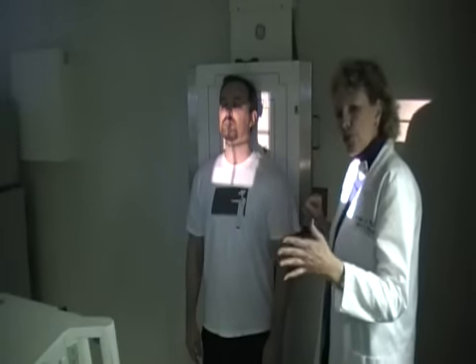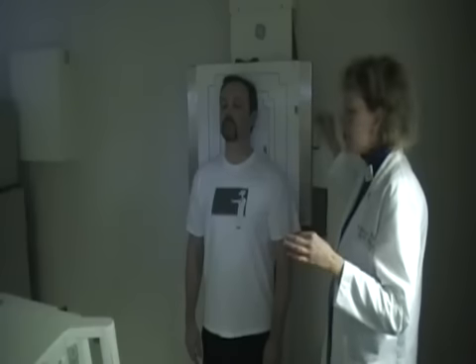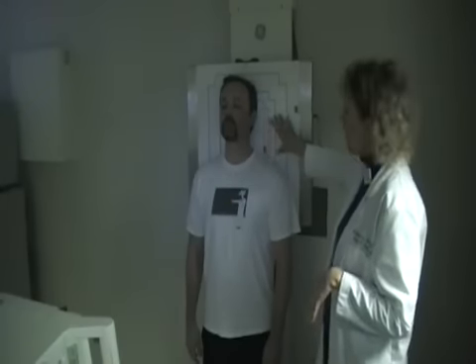Now, in the AP axial, you still use the 15 to 20 degree cephalic angle. So we don't have to move any of the Bucky or the tube. Our marker's already up there. This is the left side of the body, so there's nothing else we need to do for the AP axial.